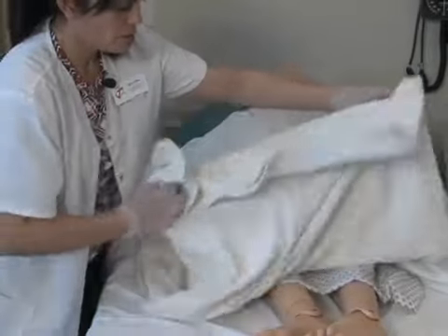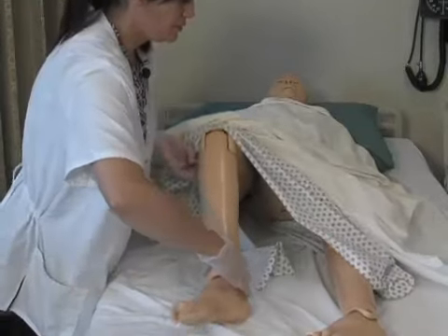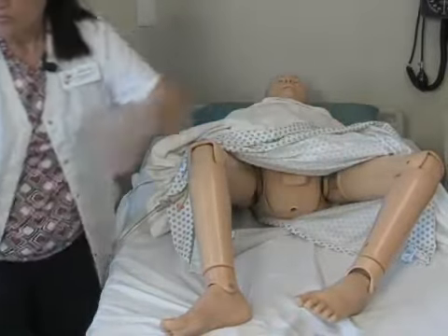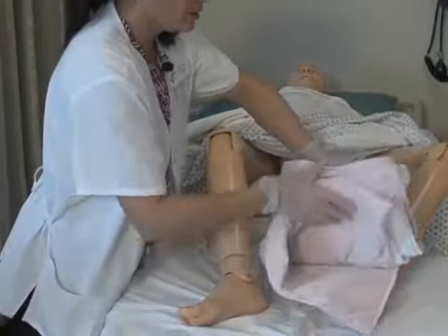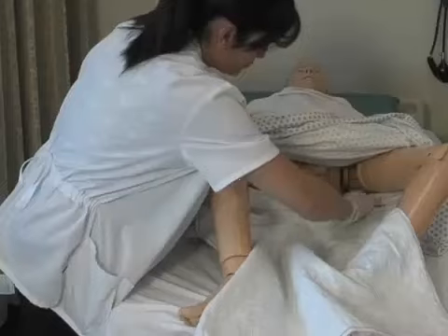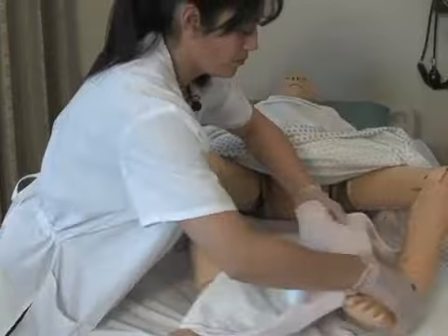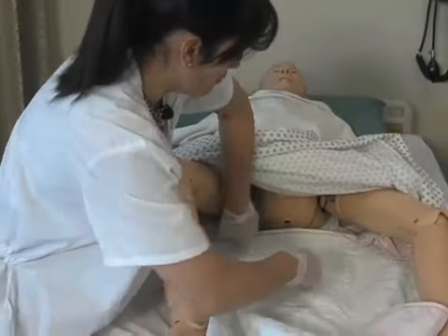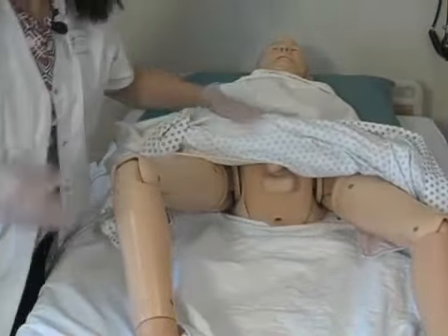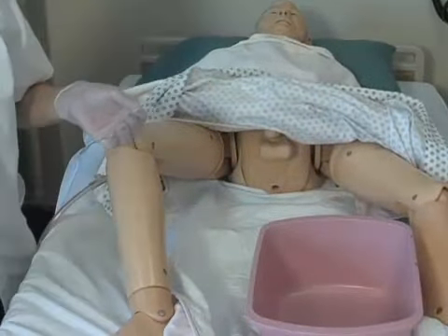I'm going to uncover my patient to his knees so I can provide catheter care. I'm going to place a bath blanket underneath my patient so I can keep the bed clean. And then I will place the basin with water.